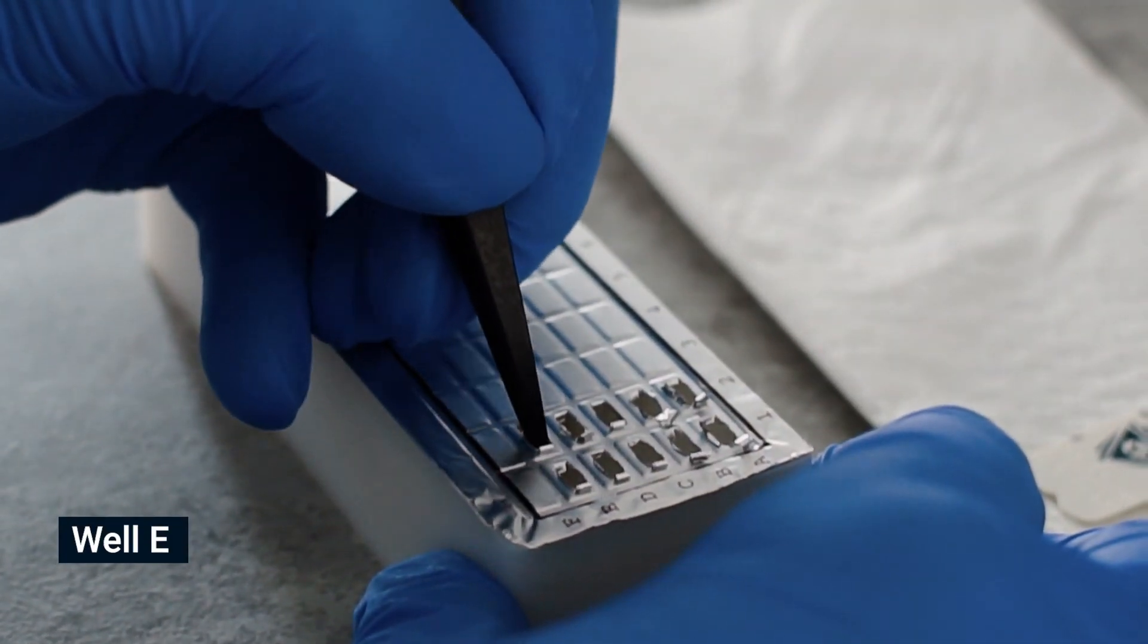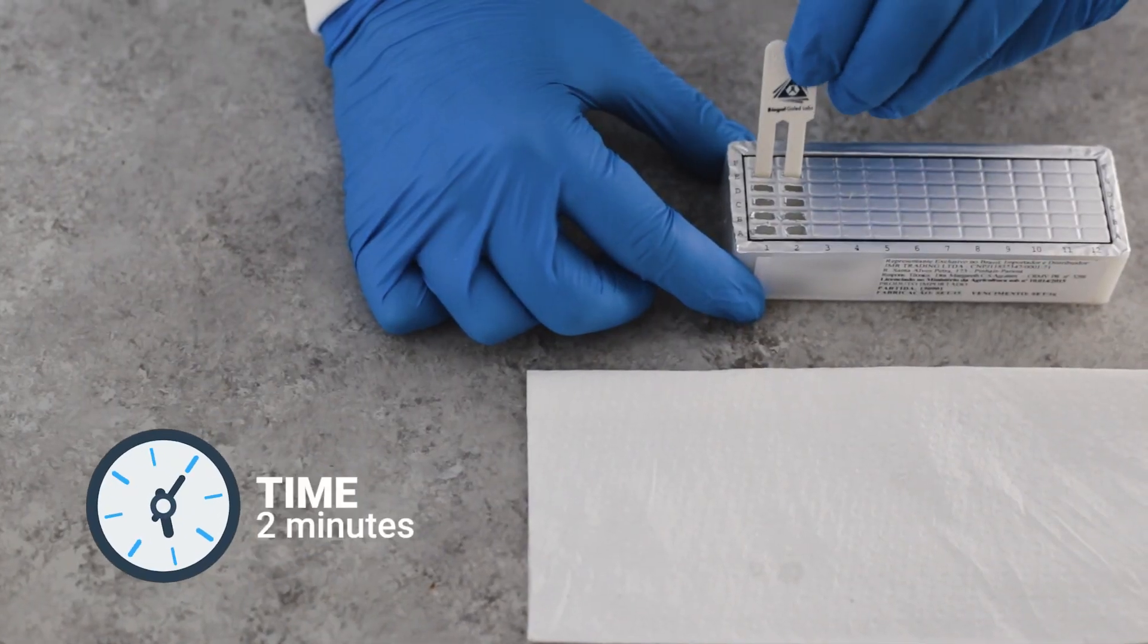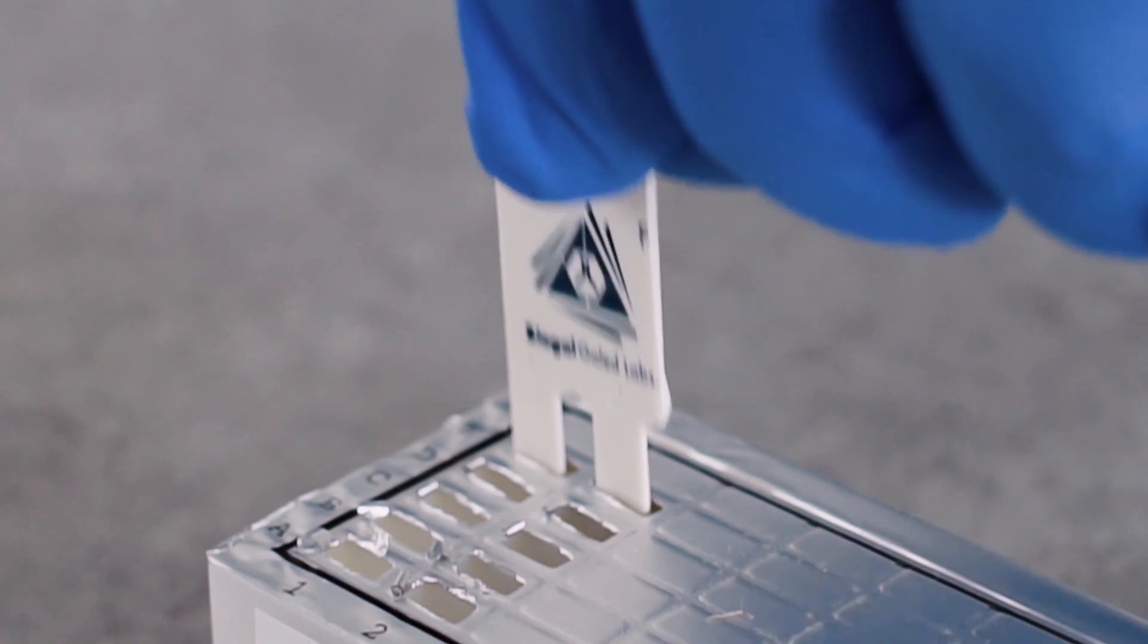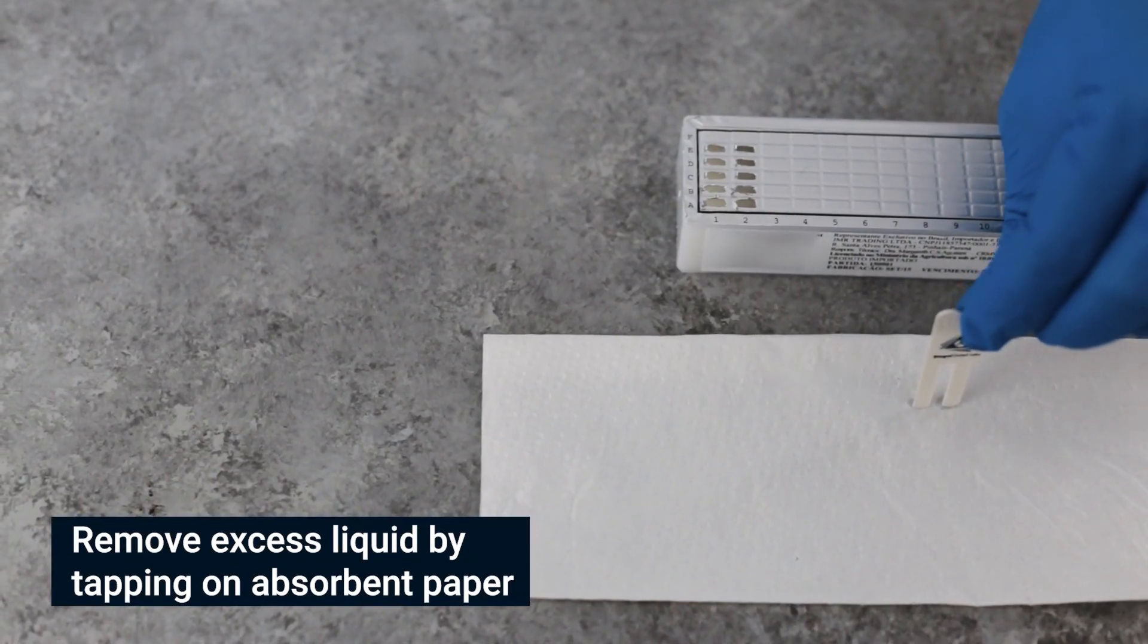Pierce the foil of the next wells in row E. Shake off excess liquid and insert the comb for 2 minutes. Move the teeth at least twice during this step. Remove excess liquid.